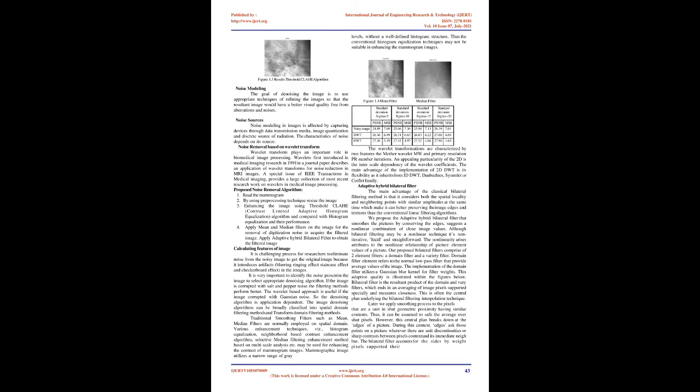The task of mammogram enhancement is to sharpen the edges or boundaries of ROIs, or to increase the contrast between ROIs and background. Balakumaran et al. It is well known that if a region differs in luminance from its surroundings by less than 2%, it is indistinguishable to the human eye. Although microcalcifications are brighter than their surroundings, the contrast for some microcalcifications in a dense breast is quite low that they cannot be detected by human eyes.